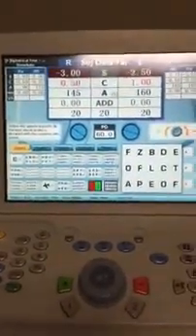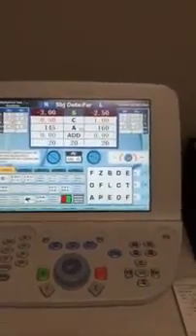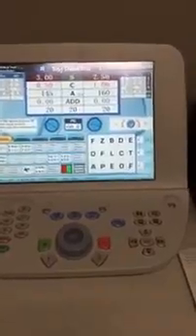Okay, so that is the complete refraction. Now it's all in the system. You can actually transfer this information to Revolution, our software system here. So we go to the computer, and here's Revolution, and I'm just going to log in and show you how to do this.